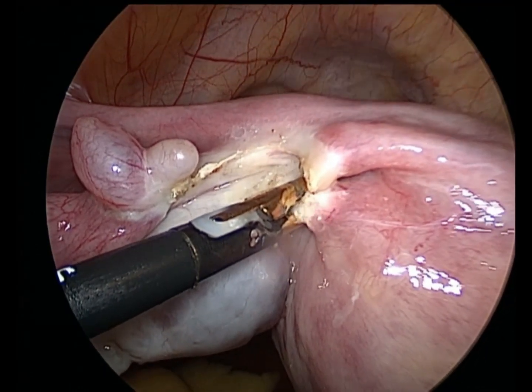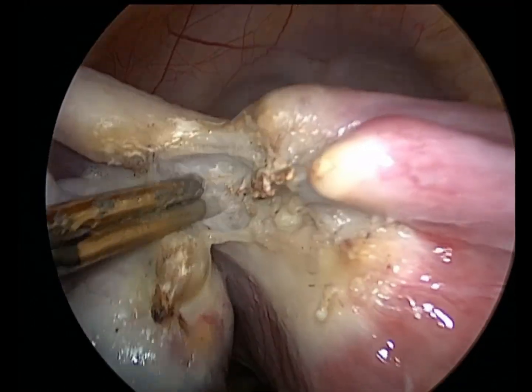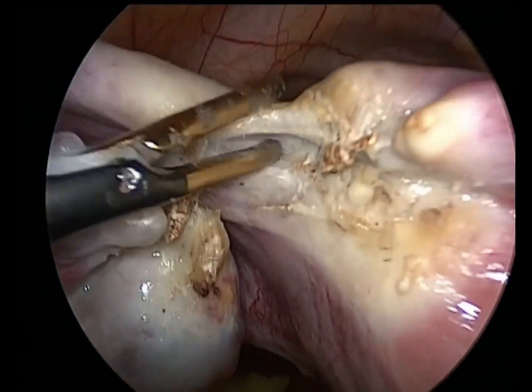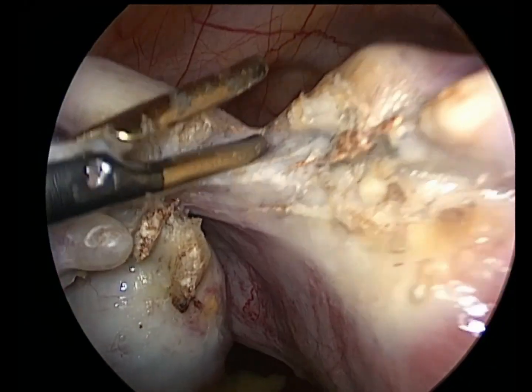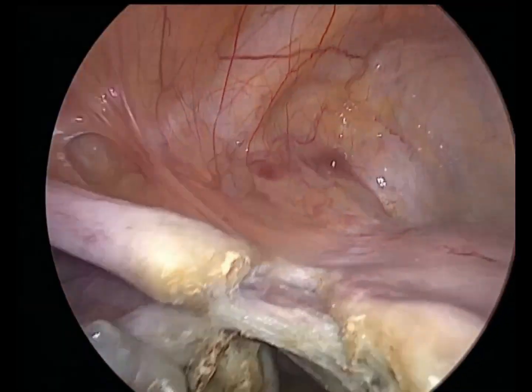Vasopressin will help in separation of the urinary bladder from the cervix at the scar site, because it will decrease bleeding and it will make the planes more visible. So this is a densely plastered scar.